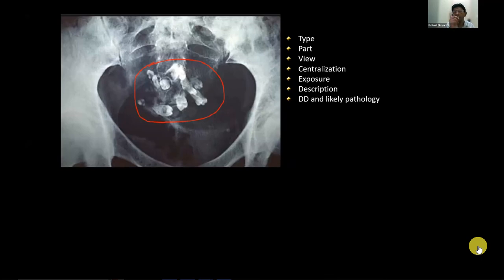Okay, so the previous one was correct, the sound, and this one, what is it? Very rarely will these be shown to you, so don't worry, but this is tooth calcification. If they give you the history, multiple calcifications, but if I tell you this is a tooth, so this is a dermoid cyst.